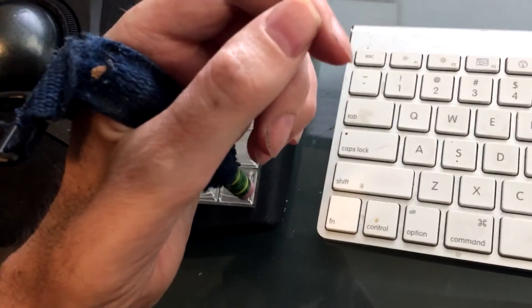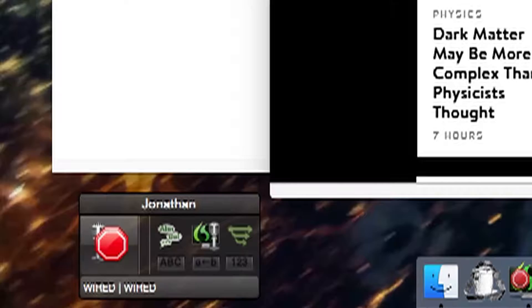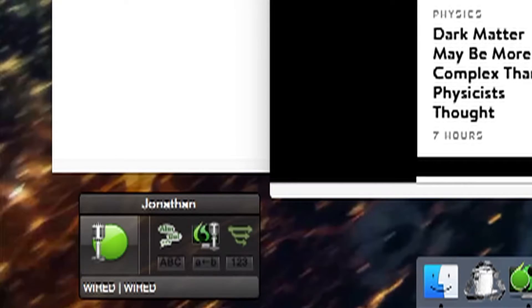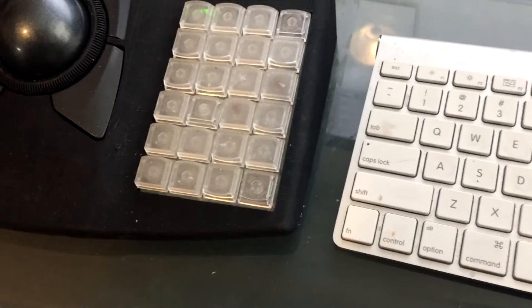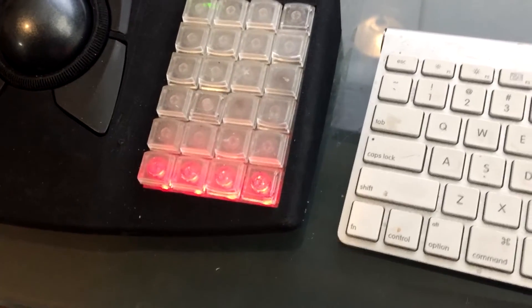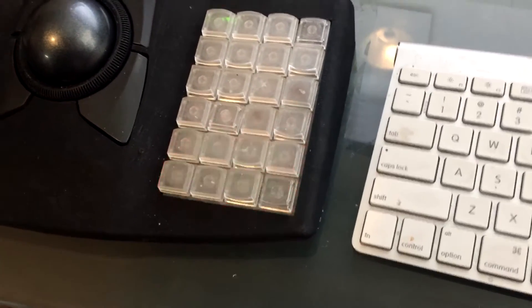Another shortcut toggles on and off my voice recognition software and flashes a red light when it's turned on.